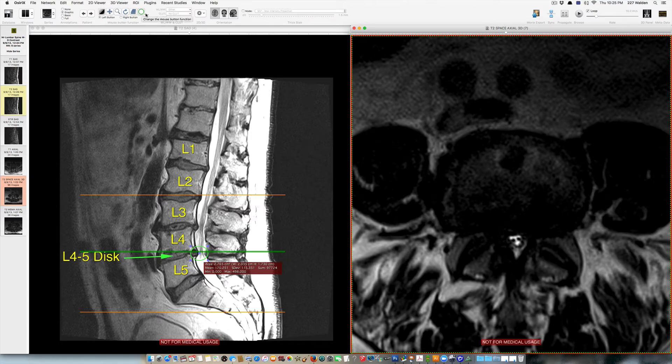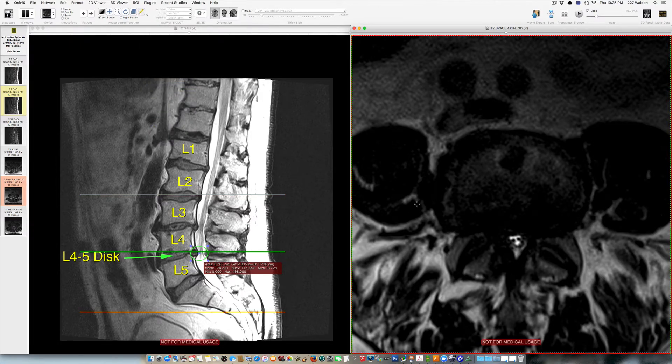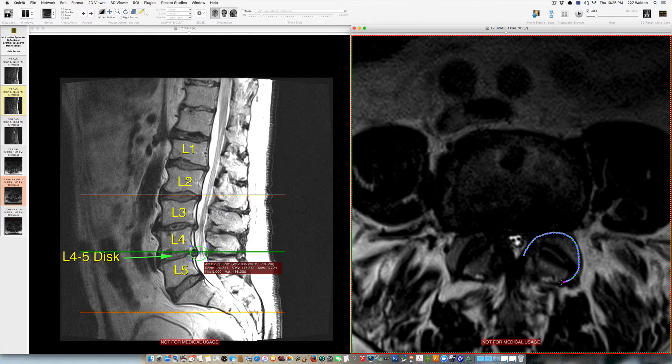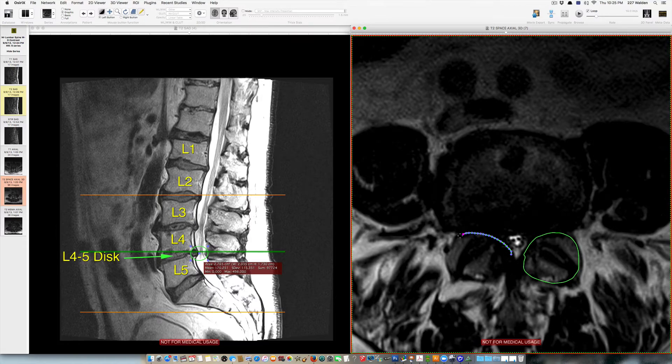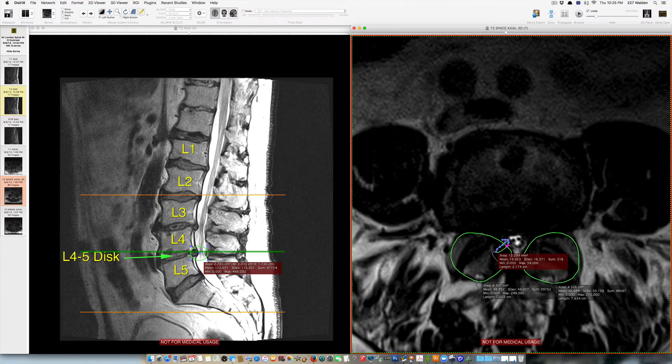Now the reason why spinal stenosis develops in this situation is that this bone mass here is called the facet joint and this gradually enlarges with age and gets larger and larger. So there's the facet joint on one side and then the facet joint on the other, and enlargement of the facet joint encroaches upon the spinal canal this way bilaterally.